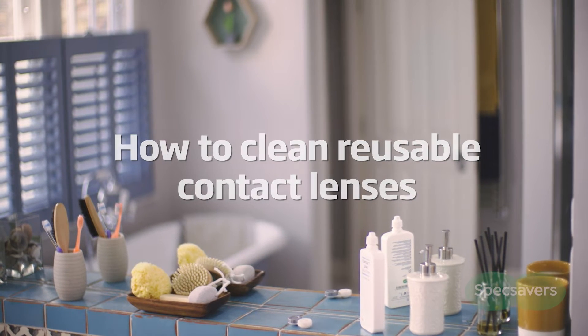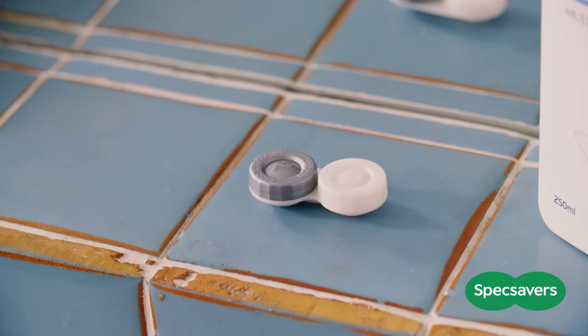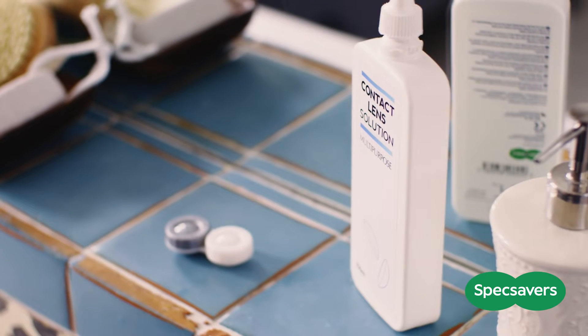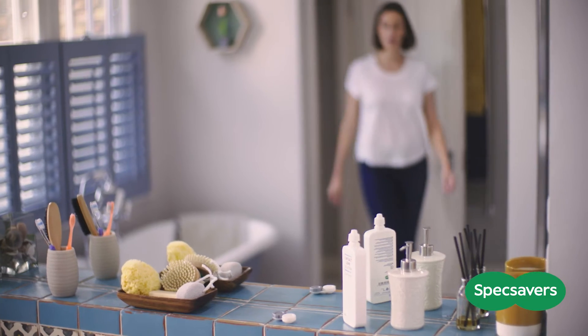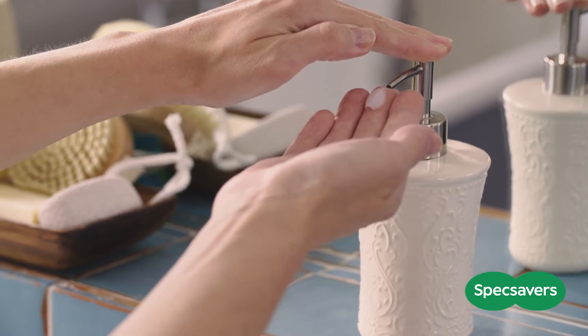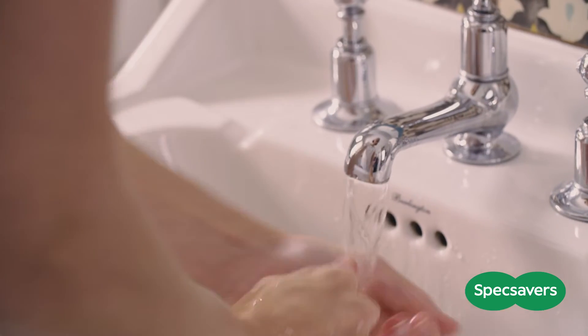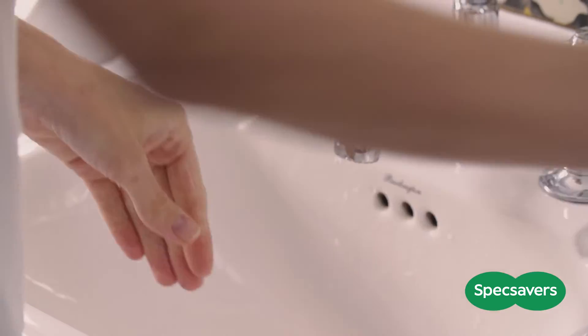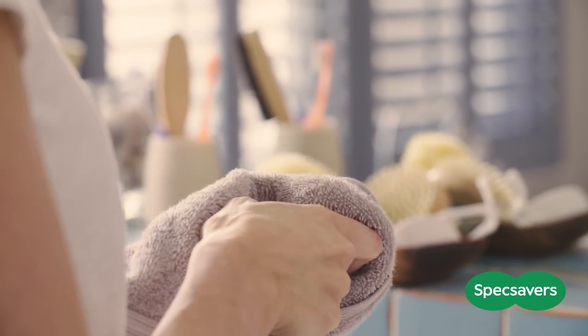How to clean reusable contact lenses. Keeping your reusable contact lenses clean is really important. The first rule for cleaning your contact lenses is never rinse your lenses or lens case with tap water. Tap water can contain certain organisms that may cause infection, but water is great for washing your hands. Before you handle your lenses, always make sure your hands are clean and dry.